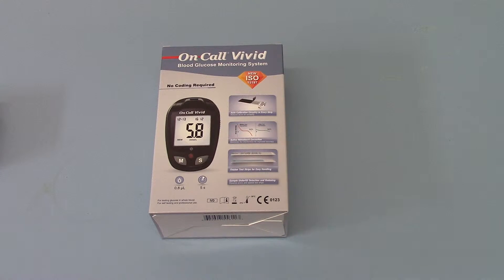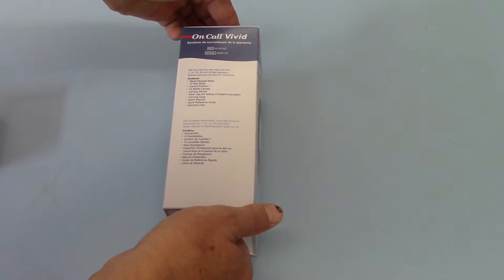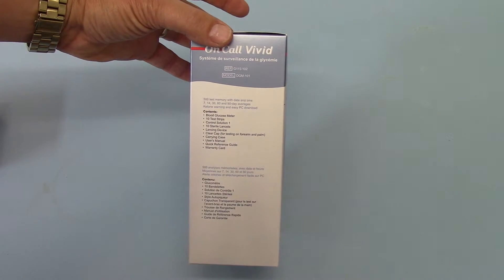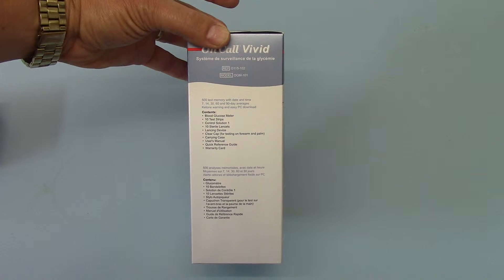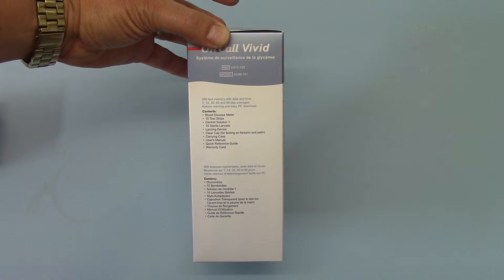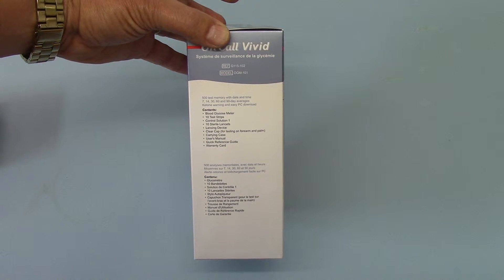The design of the meter is very simple to use. There are no code chips supplied — all the calibration is built into the actual test strips. When you first order the pack you get the blood glucose meter, 10 test strips to get you started, and a control test solution which you can practice with before your first test so you're familiar with the procedure and timings.